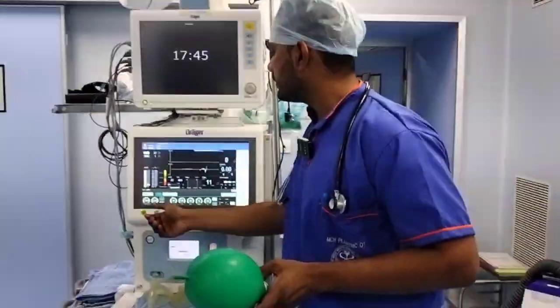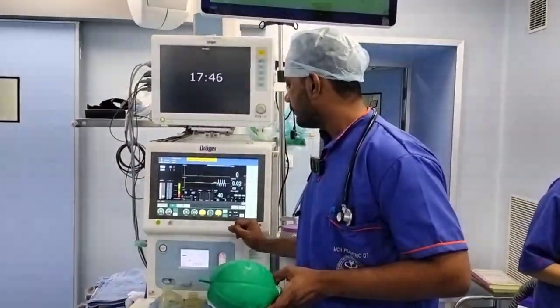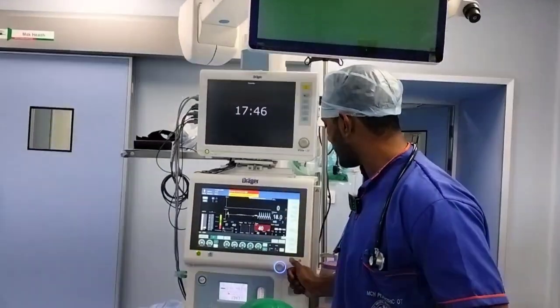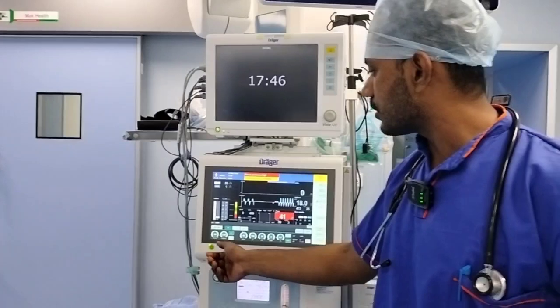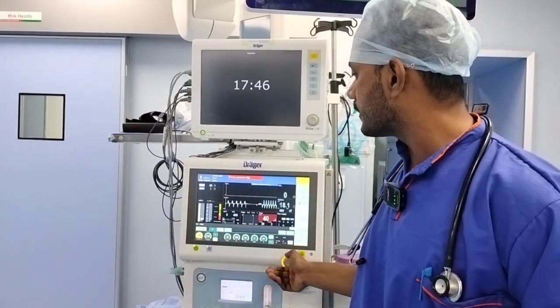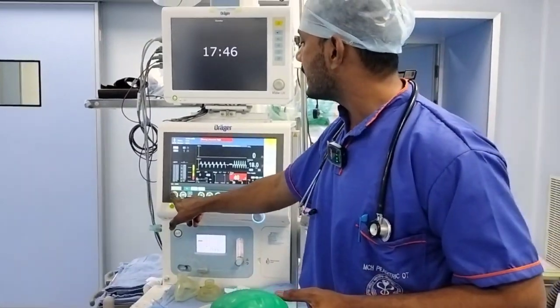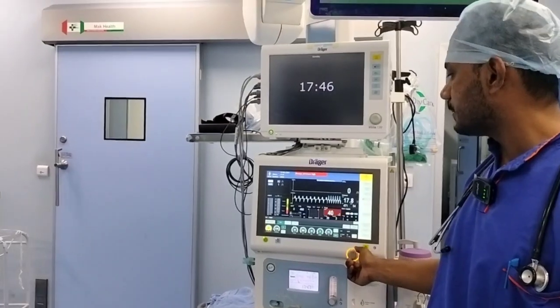One thing we will see is a few things in this ventilator. What we are seeing here is the FiO2, which means fraction of inspired oxygen. Usually in the atmosphere, the oxygen is about 21%. So here also we can keep it at 21%. We can gradually increase it to the desired level we want, up to 100%.